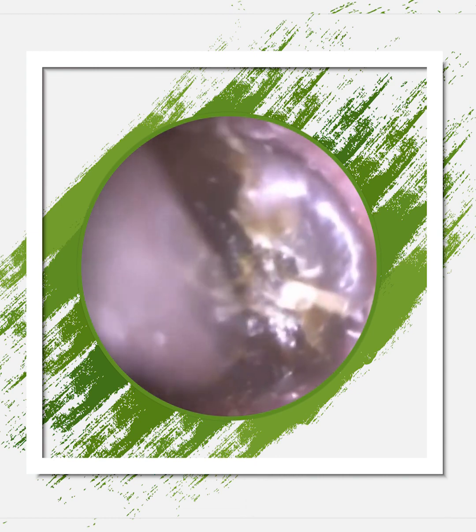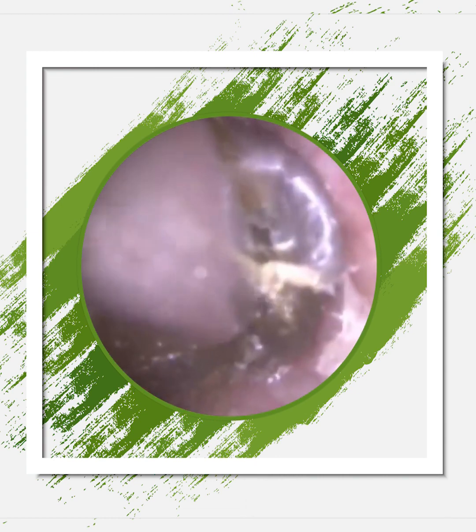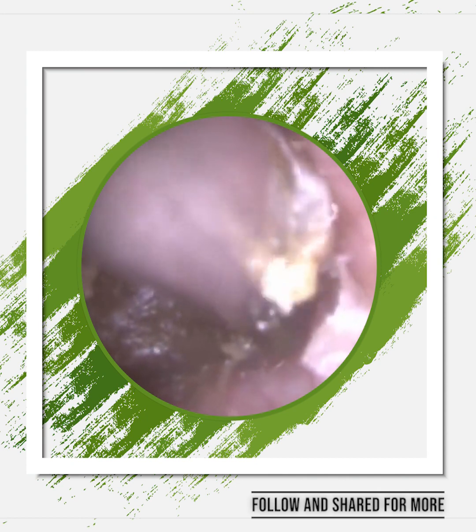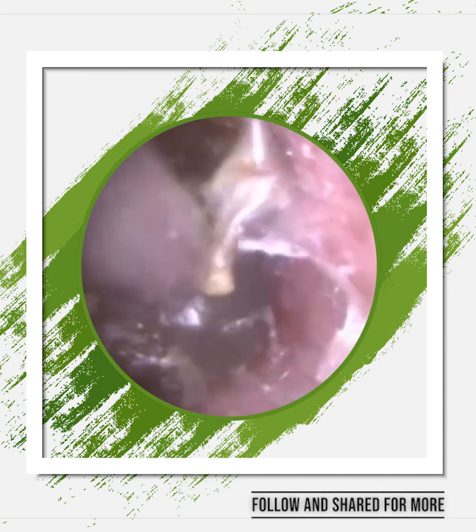So the ear canal narrows and widens, and it narrows and widens again. And this remaining plug of dead skin and wax is lodged within the second isthmus. There's a lot of dry skin adhered to the canal wall, which is also attaching to the earwax. Dead skin in the ear acts like a double-sided sticky tape. It sticks to the ear canal wall and it also sticks to the earwax, and sometimes it can be very difficult to elevate and retract the dead keratin skin both off the ear canal and also the earwax.